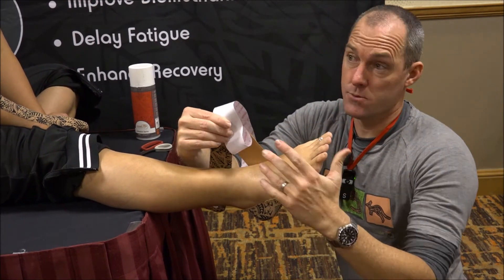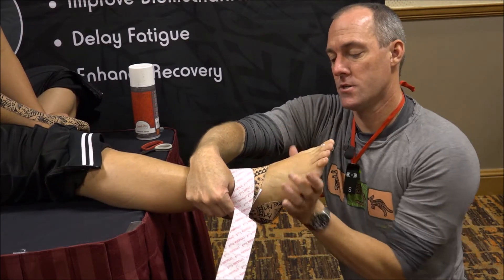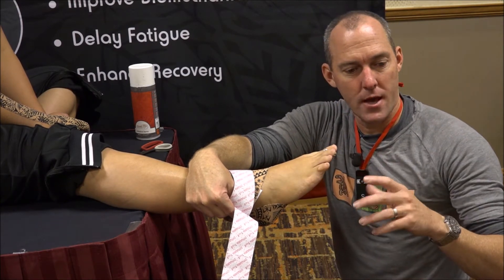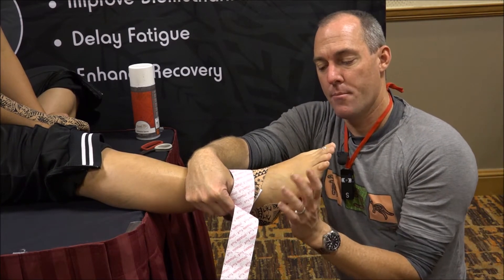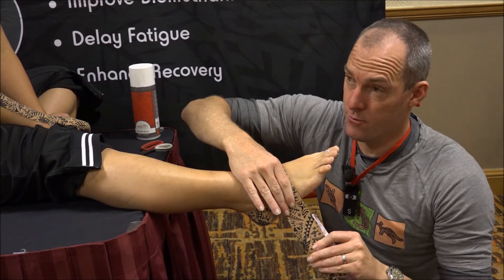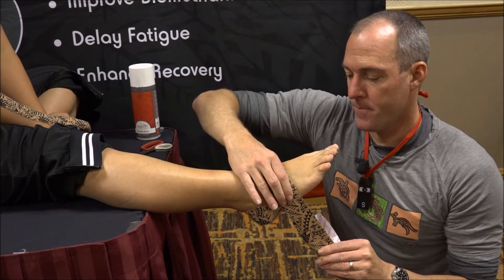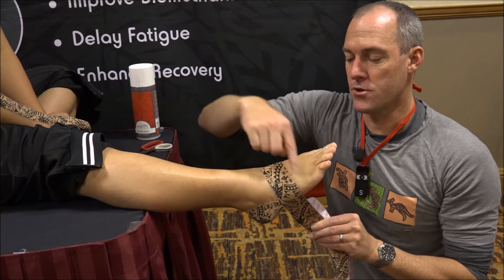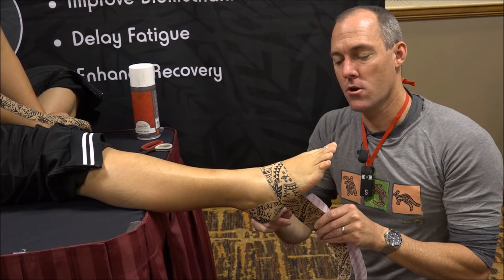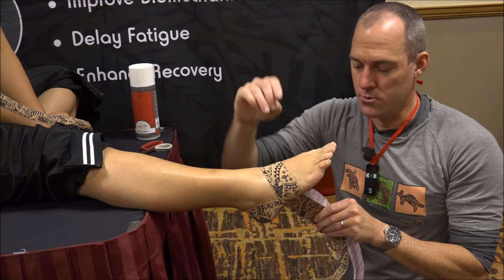You could just lock off to the lateral malleolus, and that's going to create a deceleration of the arch dropping. But sometimes, particularly in really mobile athletes — your dancers and things like that — who are really a bit unstable through the midfoot, you might want to come all the way around. This brings in another mechanism: it creates a lift of your transverse arch, and if you can maintain your transverse arch, it's much easier to maintain your longitudinal arches. It also gives compression which will help to stabilise.